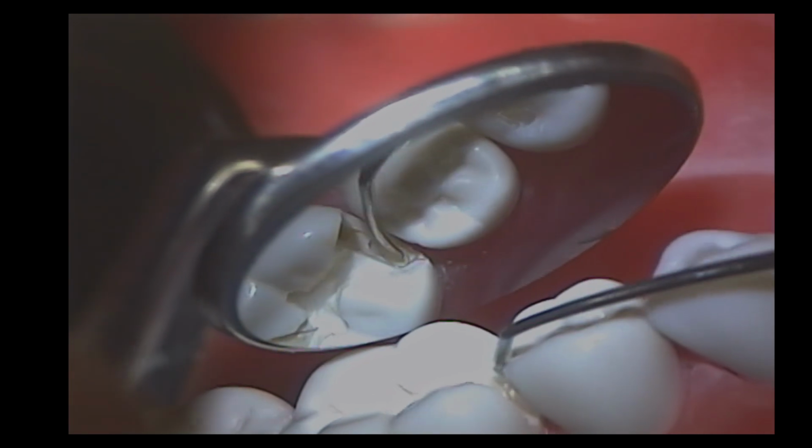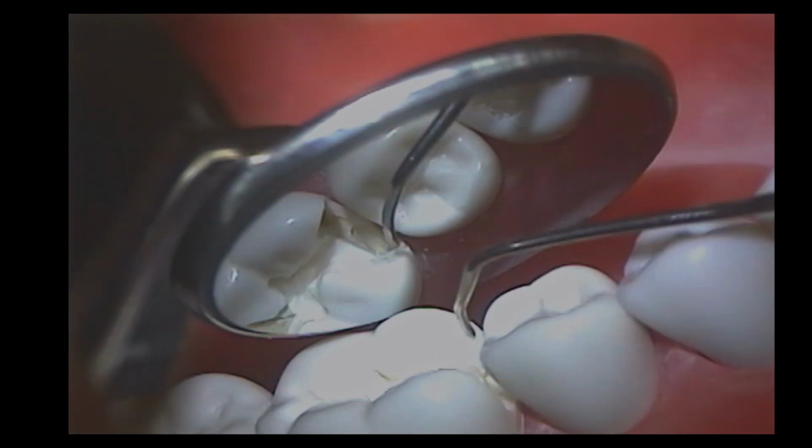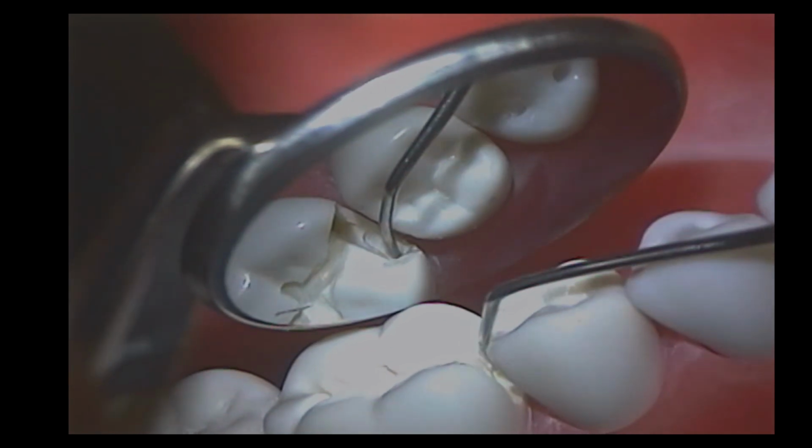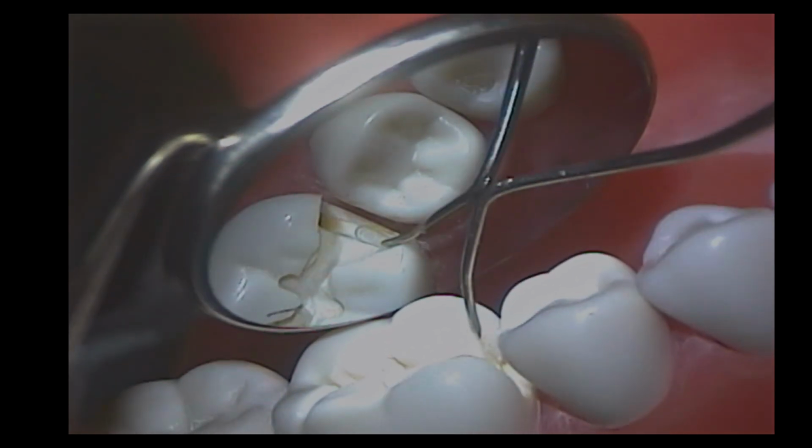Okay, so this just illustrates how you can have three different exit angles in three different positions on one wall if you have a couple of different vertical angles at the same time.